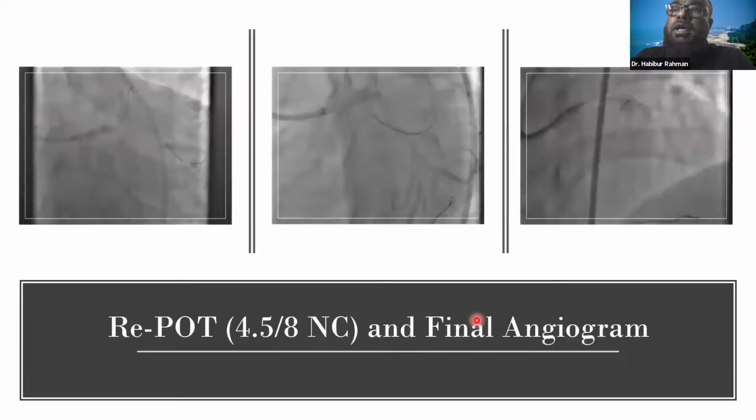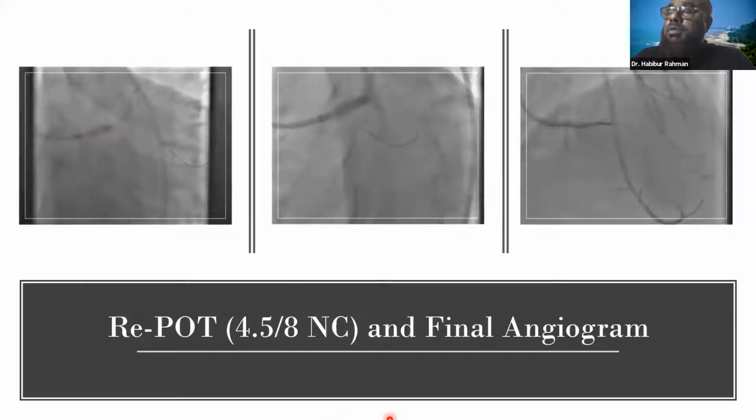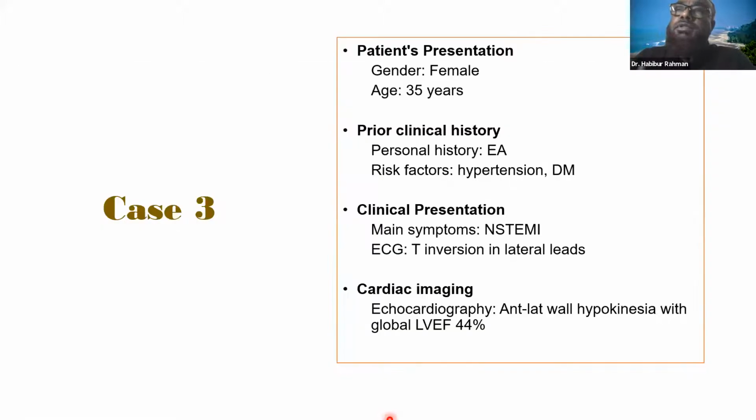POT again in the left main, and final angiogram revealed a good result.